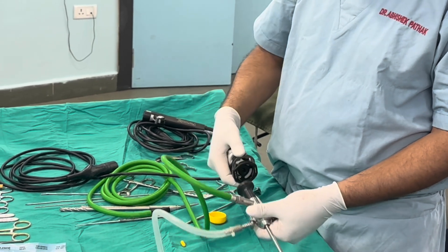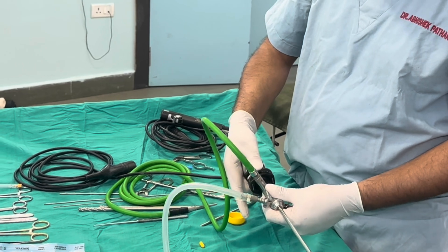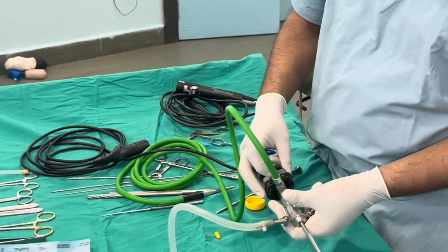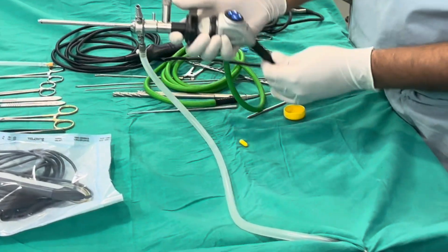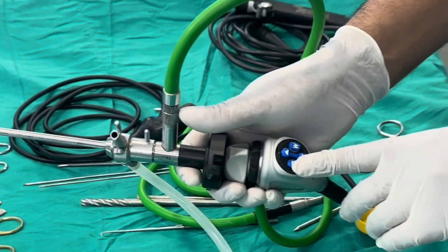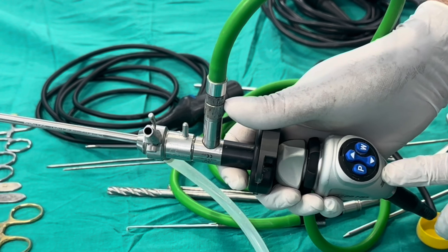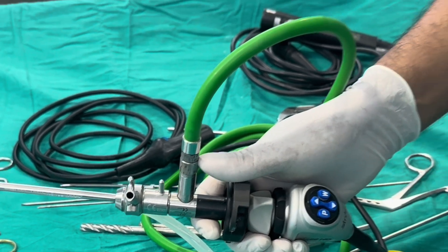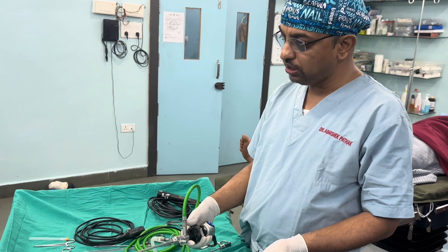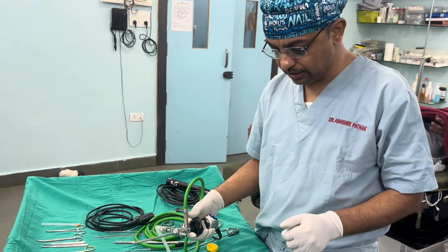After connecting the light source, we connect the arthroscope with the camera using a rapid lock system. The camera typically has two or three buttons — P for picture, W for white balance, and a control for increasing or decreasing light intensity. When putting the scope inside the joint, it is very important to perform white balance for proper colour reproduction.